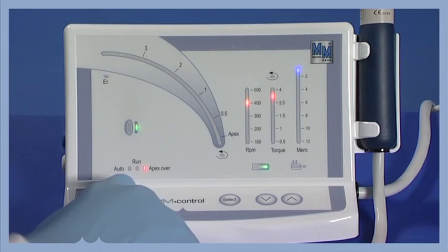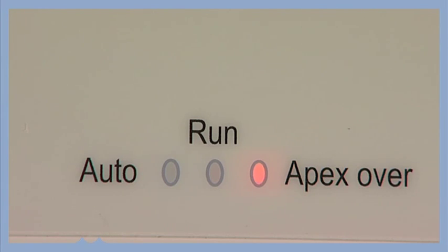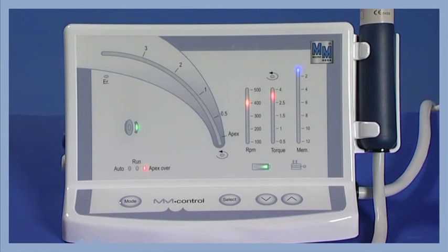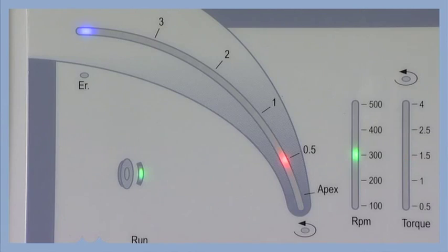In Apex Over Mode, since the control of the apical distance function is deactivated, the instrument starts automatically when entering the canal, does not stop at the apex, and goes into Auto Reverse when the set maximum torque is reached. It stops automatically when the instrument is out of the canal.